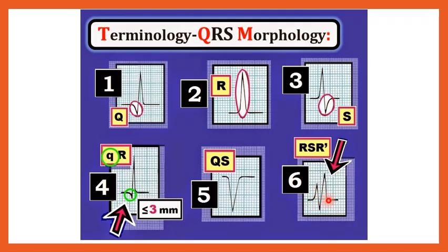We look at this, and a lot of critical care nurses will say, that's a rabbit ear shape. Look for the wide QRS with rabbit ears. And what we see with a right bundle branch block, and that's really that configuration there, is that the right rabbit ear is taller than the left rabbit ear. Just saying. Okay, so enough about QRS morphology and appropriate nomenclature.